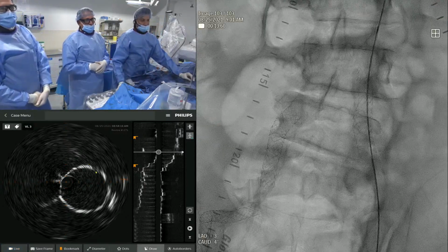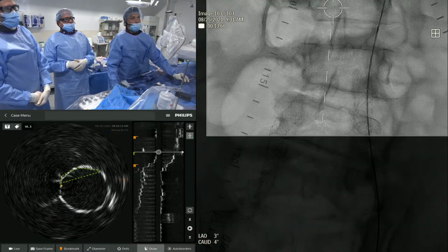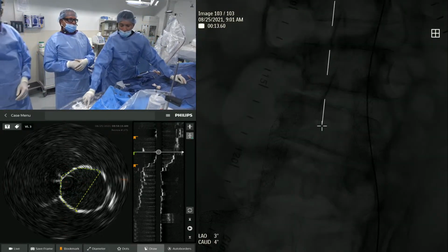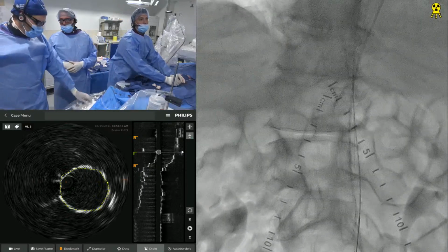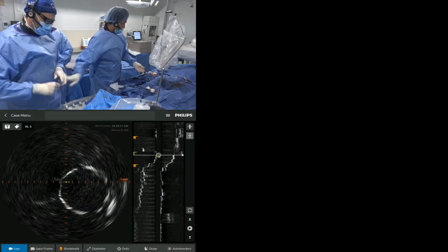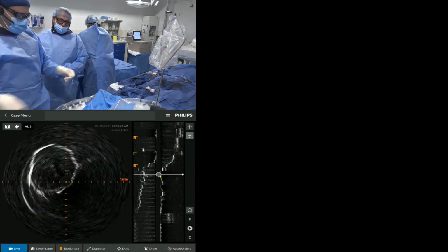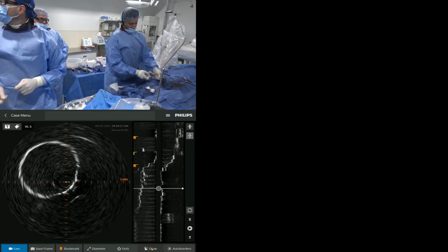I wouldn't bother. I mean, yes, I think you have an issue. I think you're going to use another coverage stent to take care of this. There's a little bit of a size mismatch as well. Yeah, I'm not crazy about doing this. IVUS-wise, there's no stenosis. We're only actually doing it for the sake of a reintervention, and Luke and I are going to do the reintervention anyway, so I don't think it really matters. So I think with that, the only question now is a question of antiplatelet therapy.